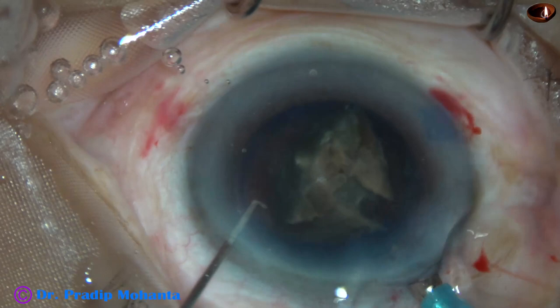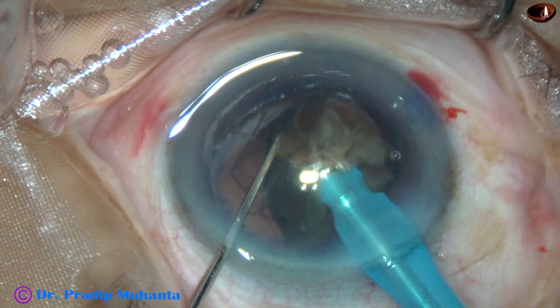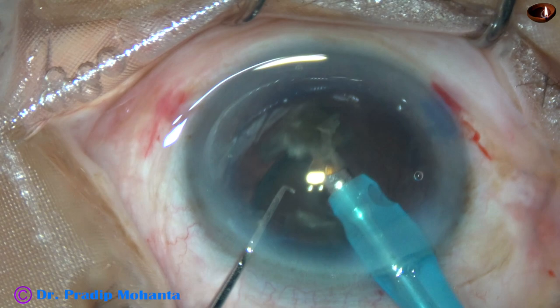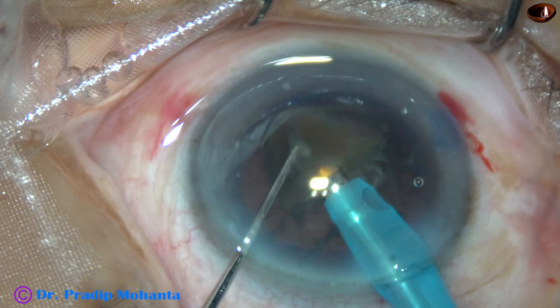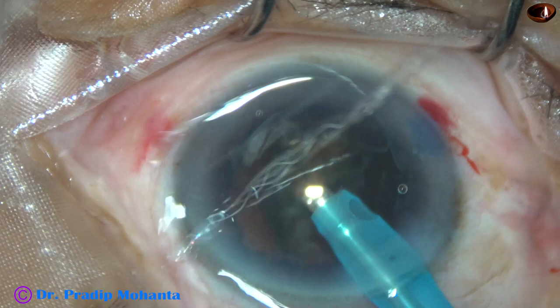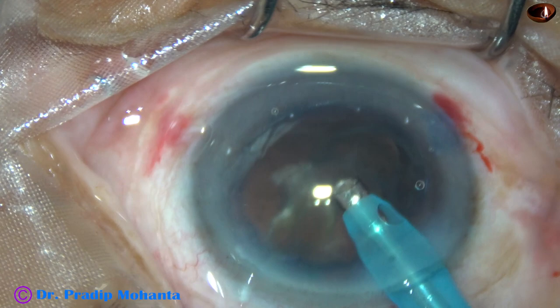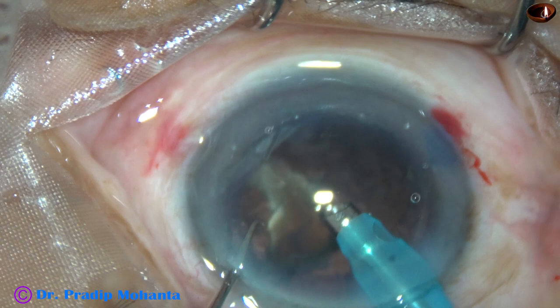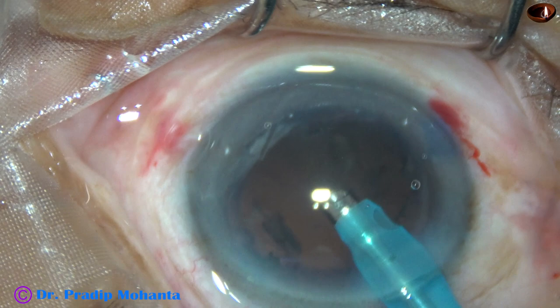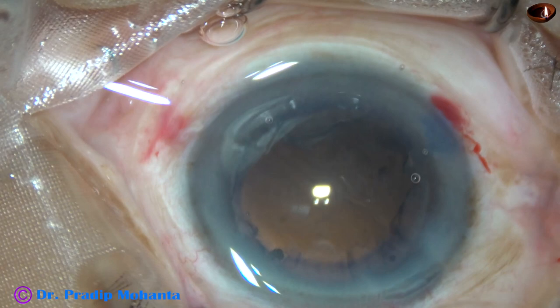This video is unedited and you are watching each and every step of the surgery. This is the last portion of the nucleus. I am still in high vacuum, high flow mode. But at this time it is a wise decision to decrease the parameters — we can even come to FACO ON mode, as I did in this case, to emulsify this last small piece. FACO ON mode means vacuum is only 60mm of mercury, flow rate is 25, and ultrasonic energy is 70%. The nucleus has been managed safely.